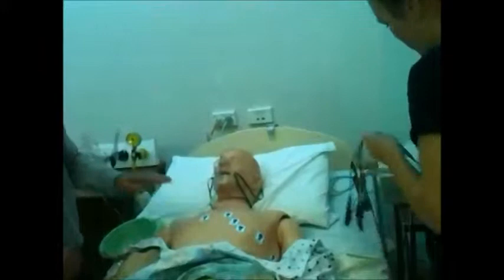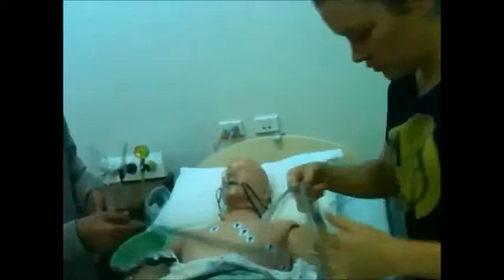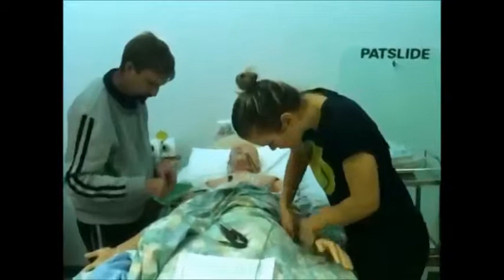Okay, so we're just going to start hooking it up. You're going to have a few wires around — it might be a bit uncomfortable, but just try and stay as still as possible. It's working. I'm going to have to put it on. That goes in the sharp end. I'm just going to expose this off. It's all good. I'm just going to change my gloves.